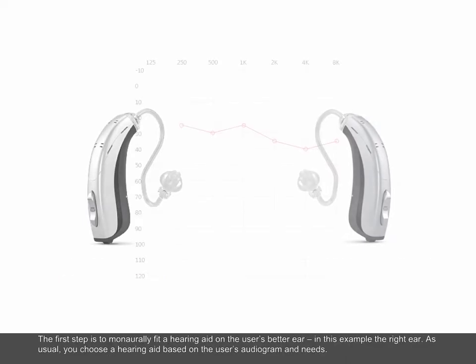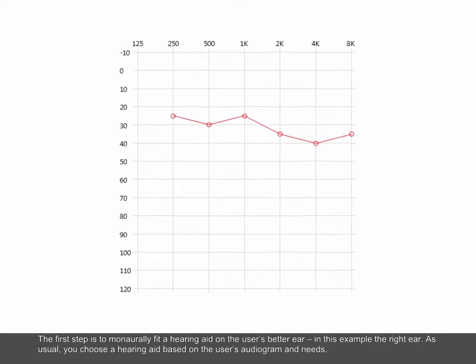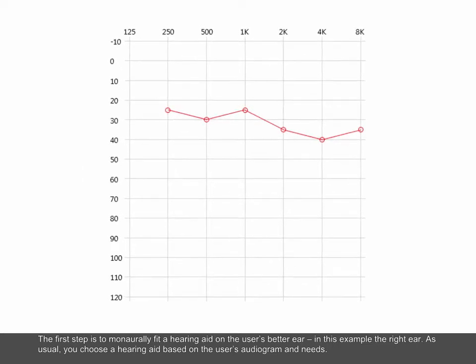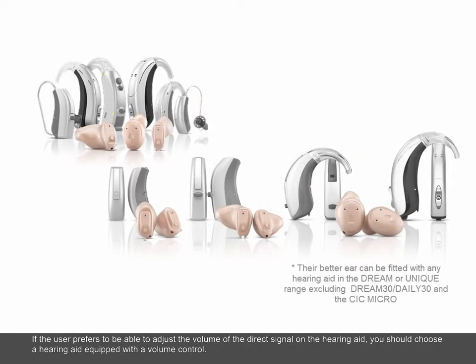The first step is to monaurally fit a hearing aid on the user's better ear, in this example the right ear. As usual, you choose a hearing aid based on the user's audiogram and needs. If the user prefers to be able to adjust the volume of the direct signal on the hearing aid, you should choose a hearing aid equipped with a volume control.